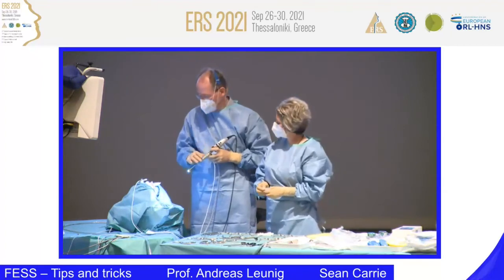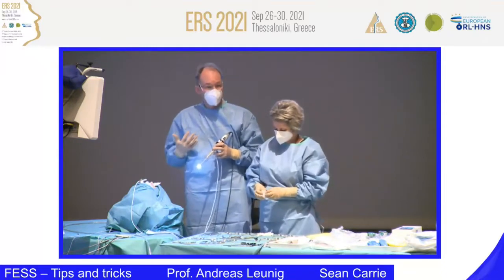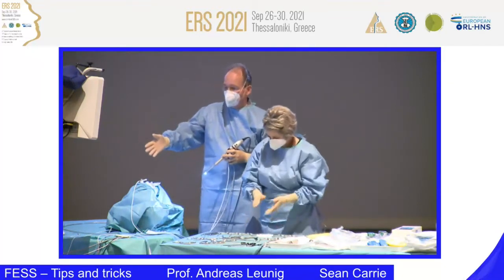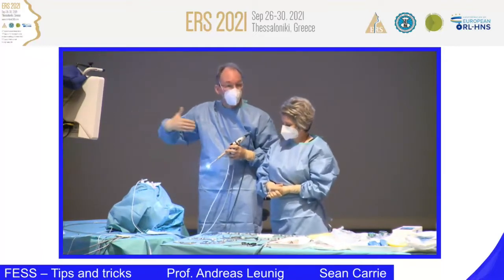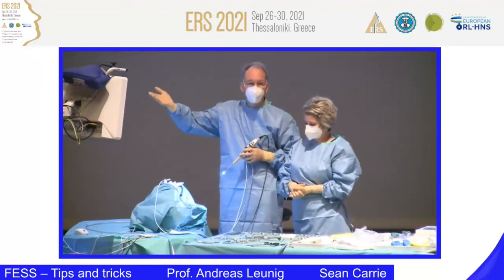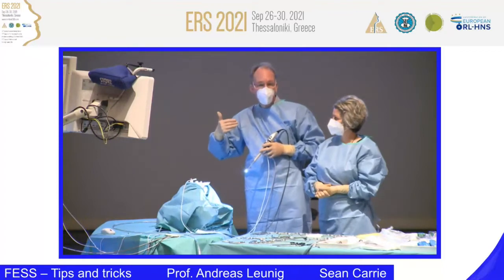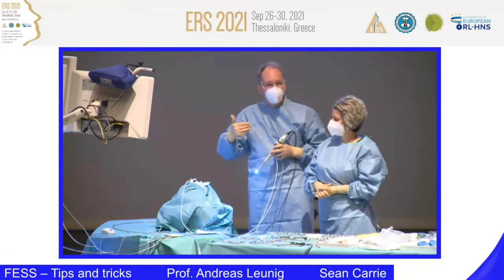That's very important. So first, we would like to introduce a little bit the setup, which is very important for me. I could just rush into the dissection, but let me take 5 minutes to demonstrate. We have this so-called Navi card. It's a video tower, and you have different things. This is, for demonstration, a little bit more than we have in our OR. We have a monitor for the endoscopic picture, as well as a monitor for the navigation system. And we're using navigation. Why? Because we are definitely convinced it's more precise, more personalized, more predictable when you use navigation.